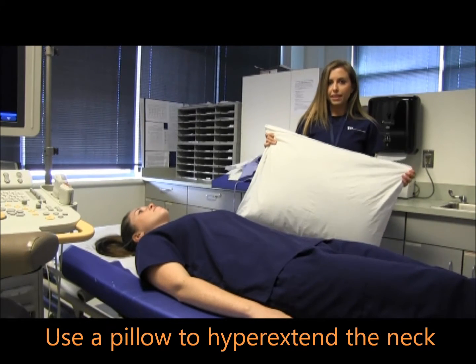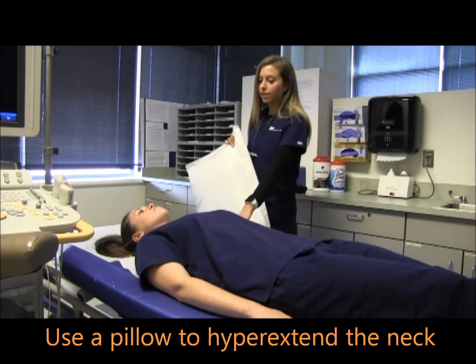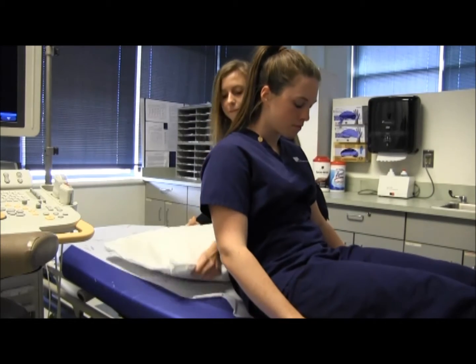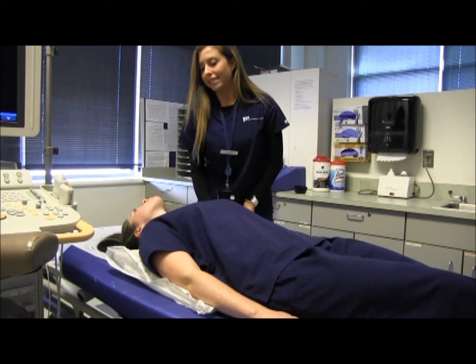For a thyroid exam, the first thing you want to remember to do is place a pillow underneath the patient's shoulders to help her hyperextend her neck. And now her neck looks ready to scan.